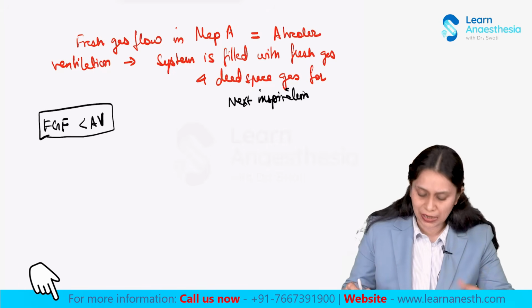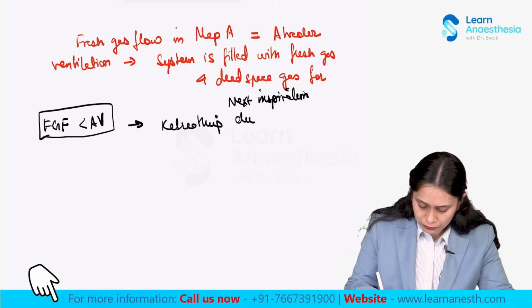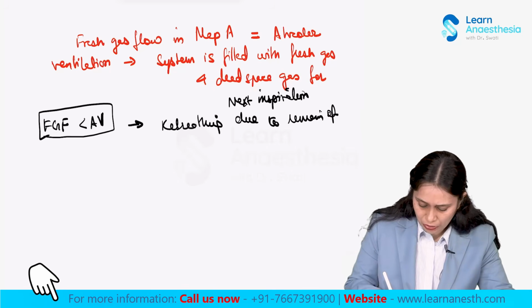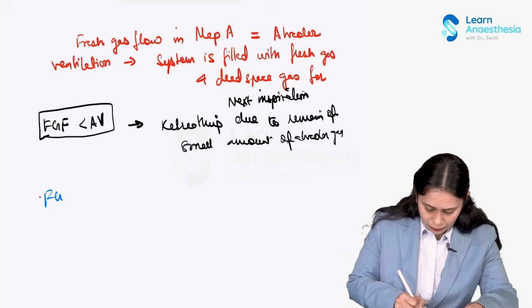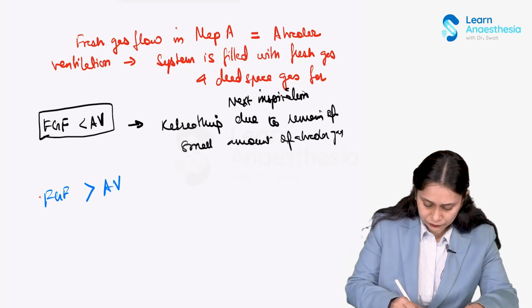So rebreathing will happen, due to remains of a small amount of alveolar gas, okay?